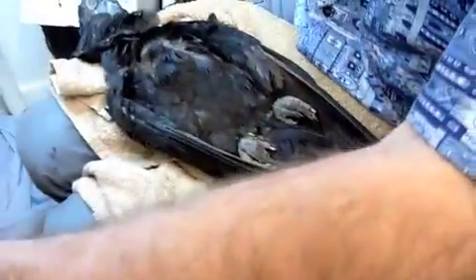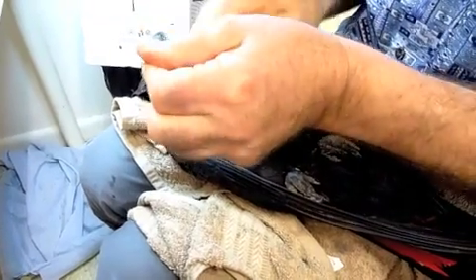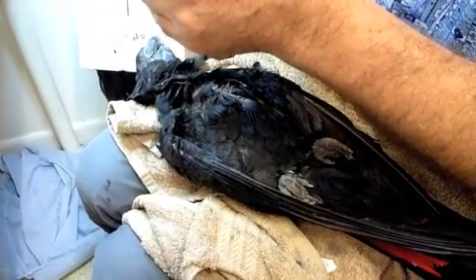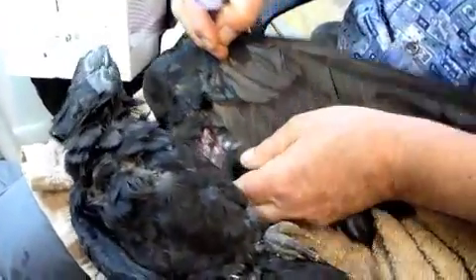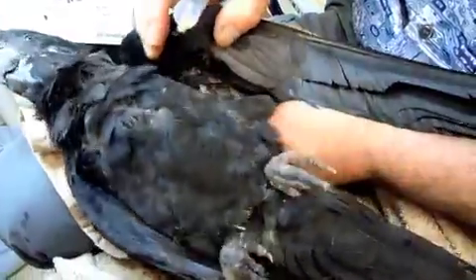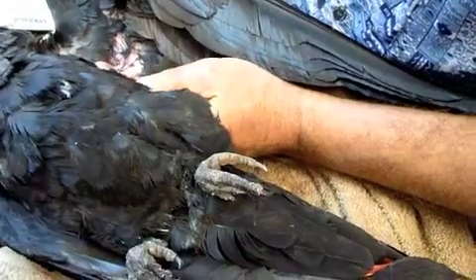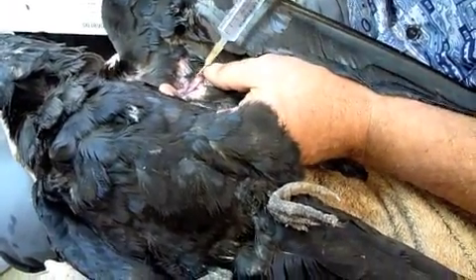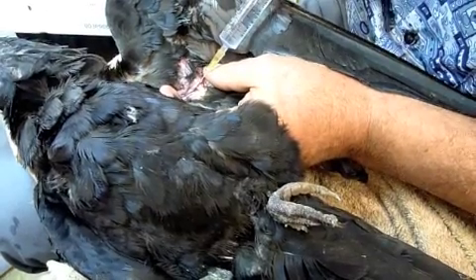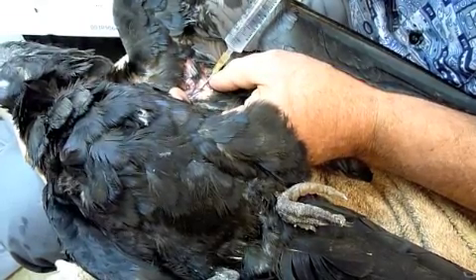You have to be awake, don't you. Stay awake, stay awake. Intravenous fluids. Steady, steady mate. We'll see how calm we can keep him while we do this, and if he holds still we'll be blessed. They often get a haematoma here.